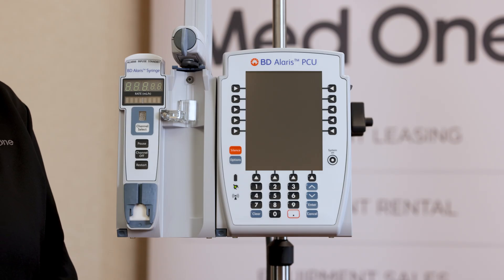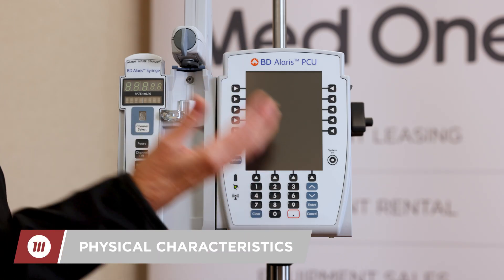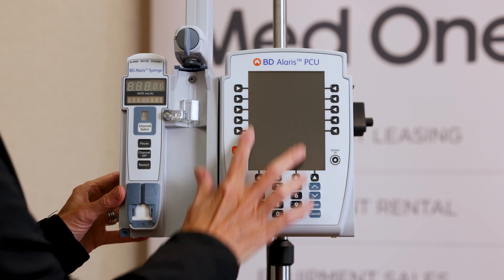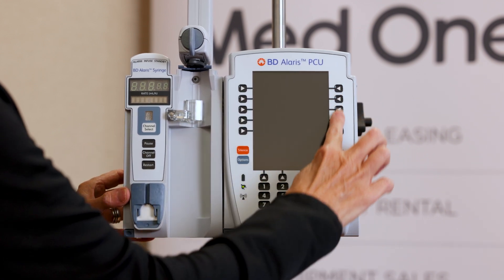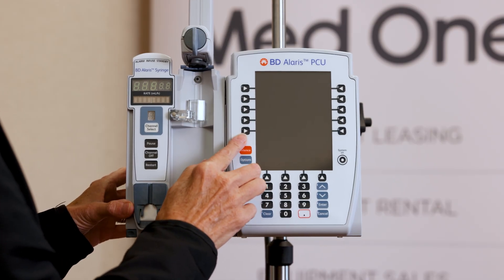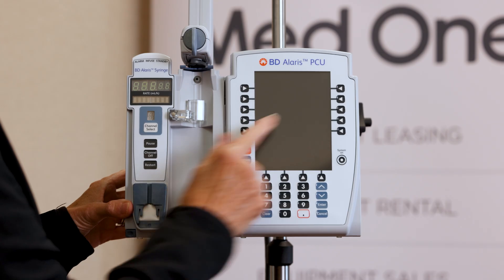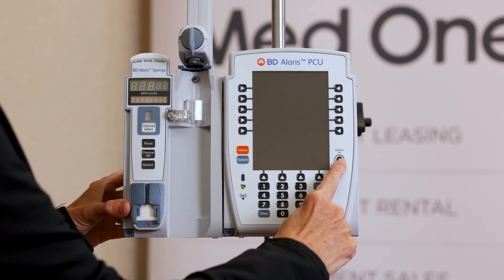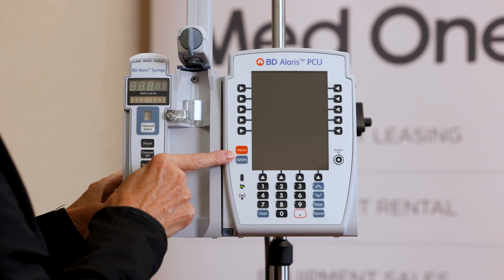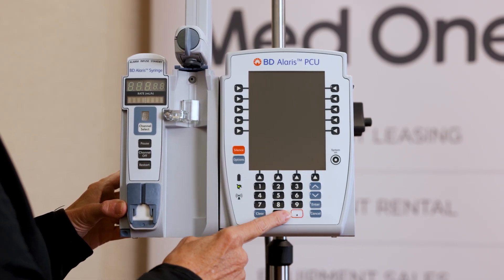Now I'm going to talk about some of the physical characteristics of the PCU and the syringe pump. The PCU has a large screen surrounded by arrow keys. They will correspond with a prompt like start, rate, or volume to be infused. There's a system on button — there isn't a system off. There's also silence, options, your numeric keypad, and your decimal, which is highlighted in red.